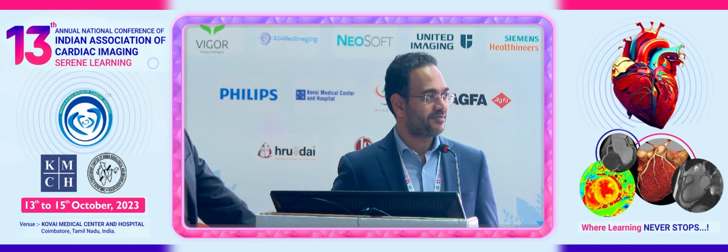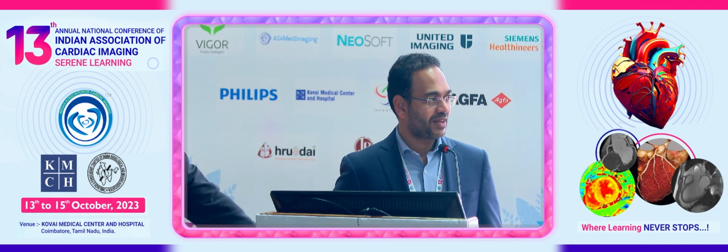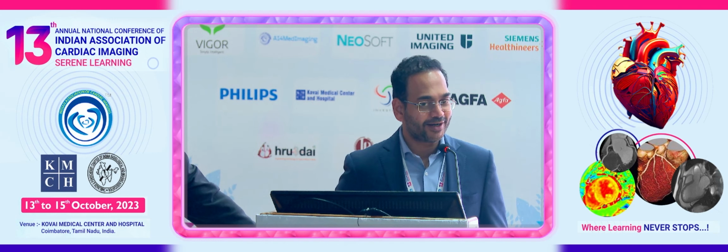So yes, if you have high-risk plaques versus no high-risk plaque, that's a no-brainer. But within that, whether it's a spotty calcium, whether it's a napkin ring, does it make a difference? Versus the extent of atherosclerotic disease, number of plaques, does that correlate with the incidence of mortality or acute events? I think that's a great question.